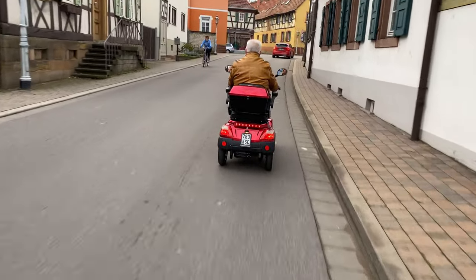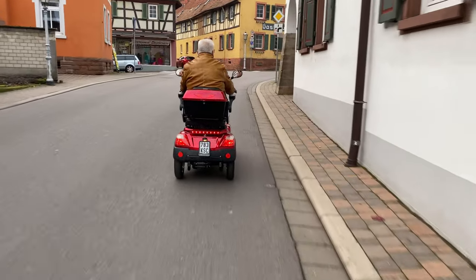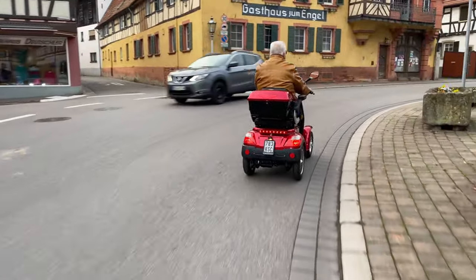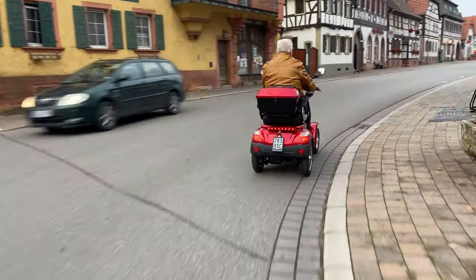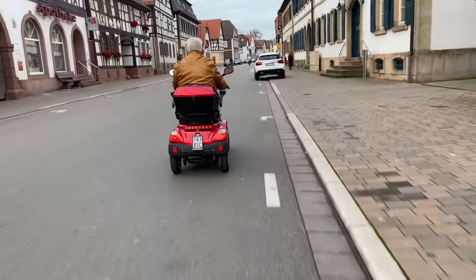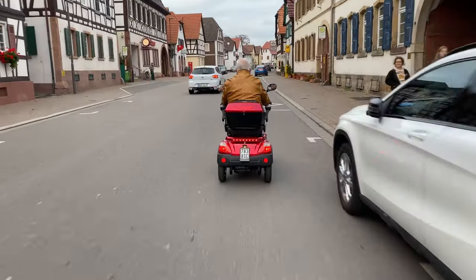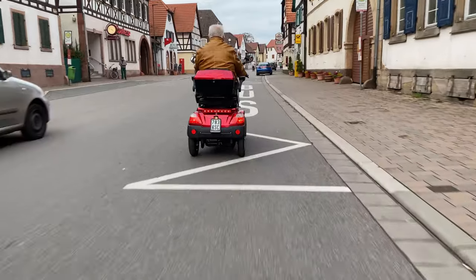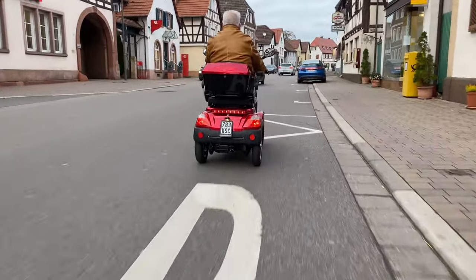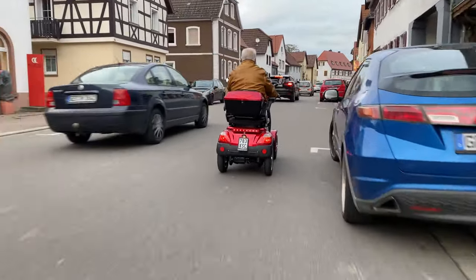Do you need a driver's license? In Germany, mobility scooters are considered to be patient wheelchairs if they can travel a maximum of 15 kilometers per hour. With this classification, you can drive straight away without a driver's license or registration. It goes without saying that the driver must be able to move the vehicle safely in traffic, both physically and mentally.